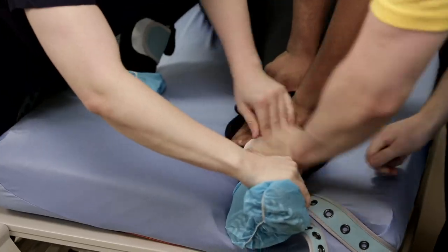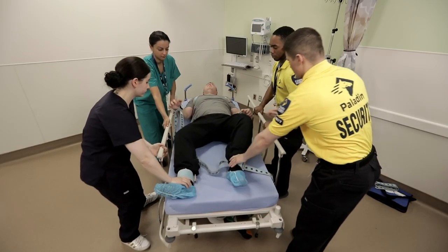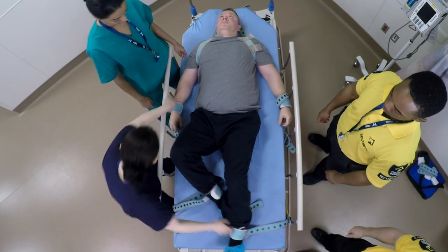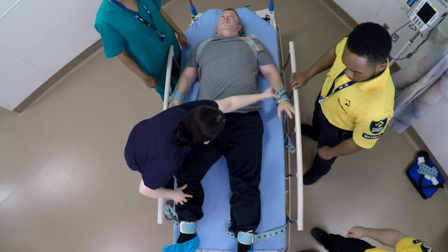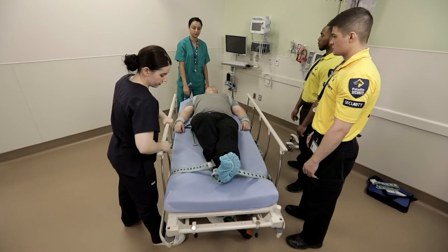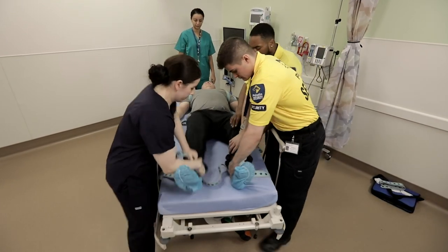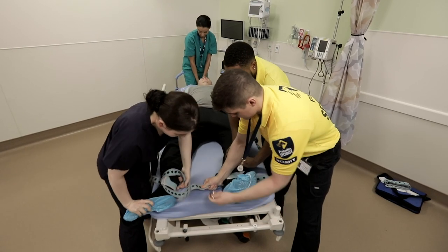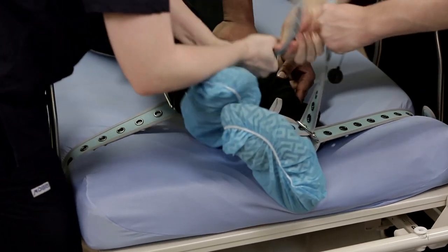After all four limbs are secured, raise the side rails and proceed to adjust the limb cuffs for optimal contact. Remove any jewelry or clothing underneath the cuff. Should you perceive a risk that the patient may break the Velcro hold, Pinel recommends supporting the Velcro with the overlapping straps. This is particularly true with the ankles, where there is less overlapping Velcro to hold very powerful legs. The patient is now secure on the stretcher.